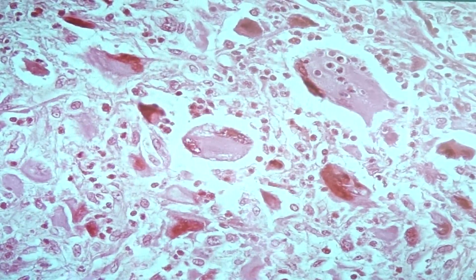Histologically, this is very easy to identify. You can see the presence of very large cells having bizarre nuclear features.